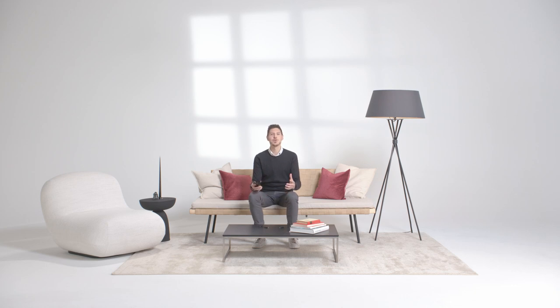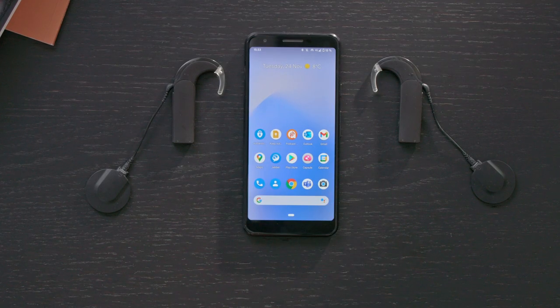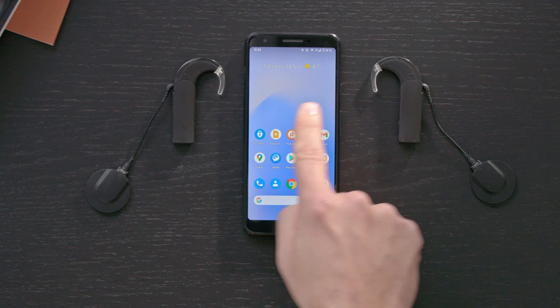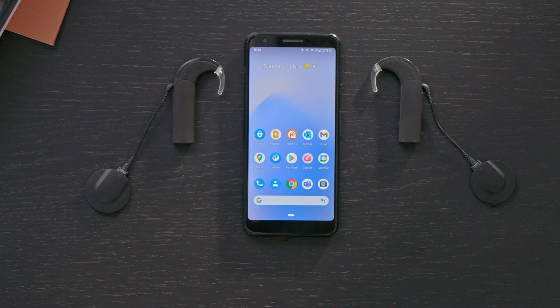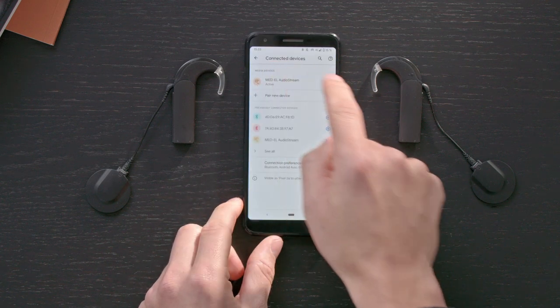With AudioStream, you can stream phone calls straight to your Sonnet Series audio processor. I'll show you how. To use AudioStream for a phone call, make sure that AudioStream is attached to your audio processor. Check that your AudioStream is paired with your phone and that a Bluetooth connection is established.